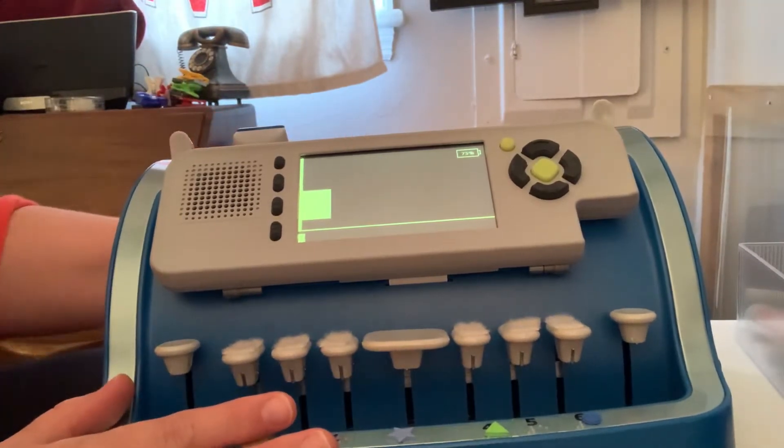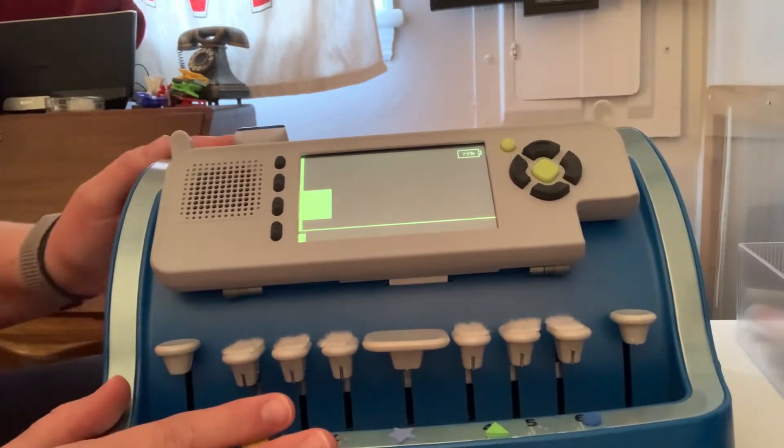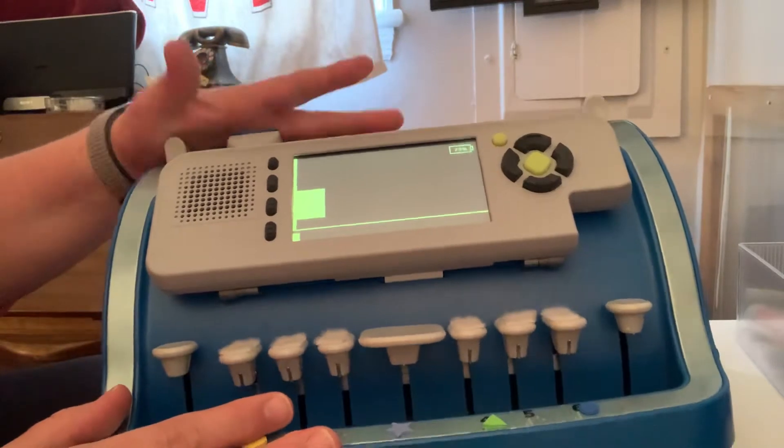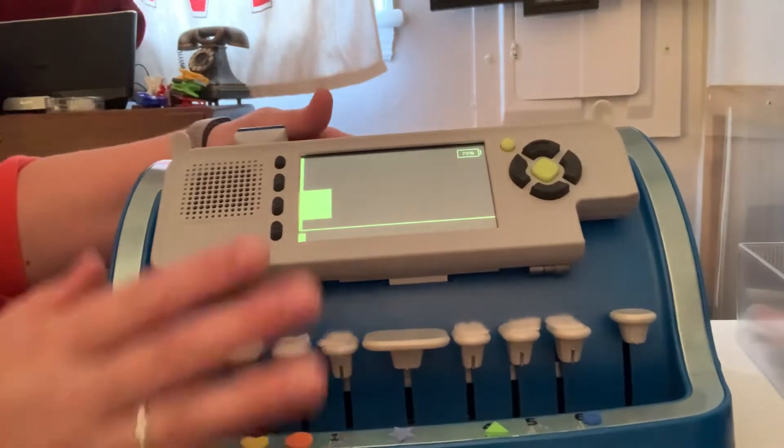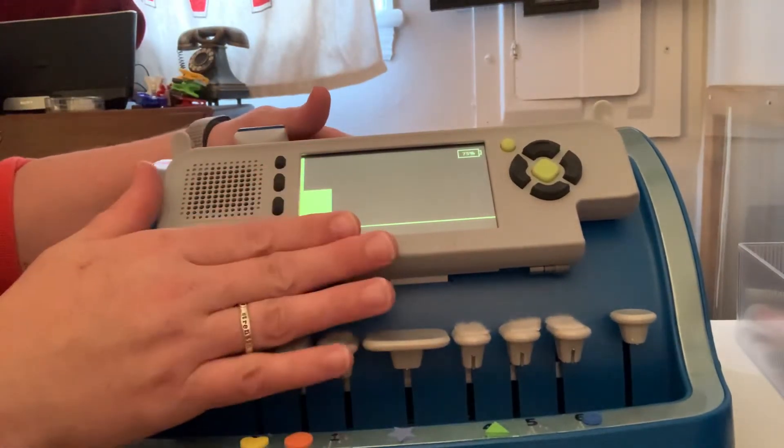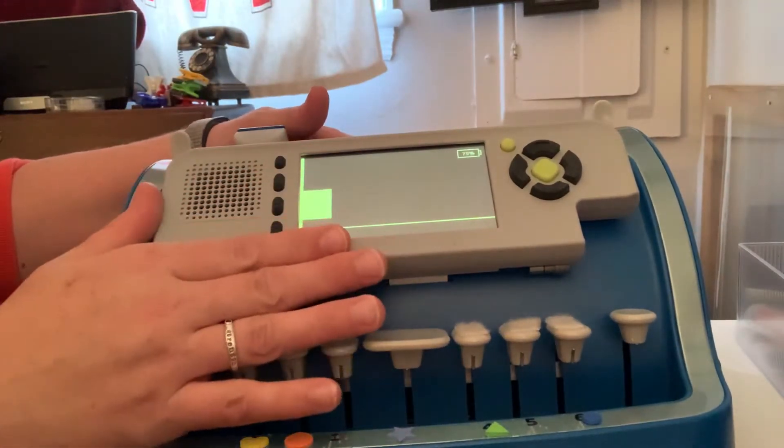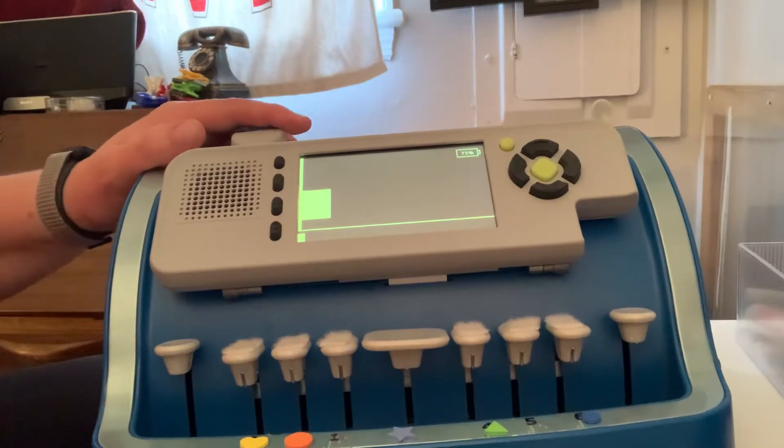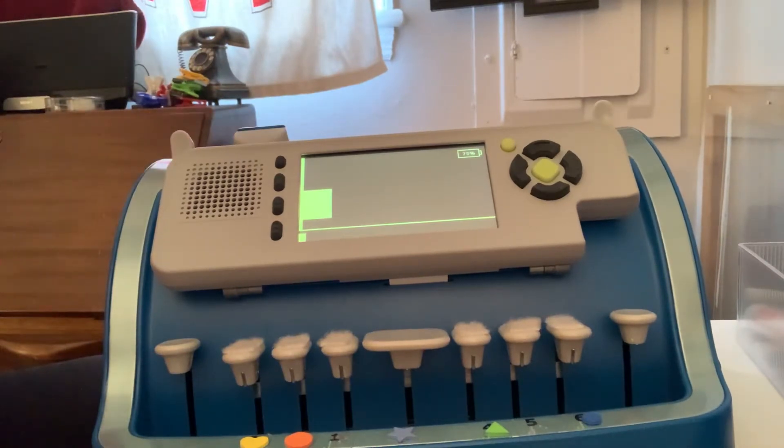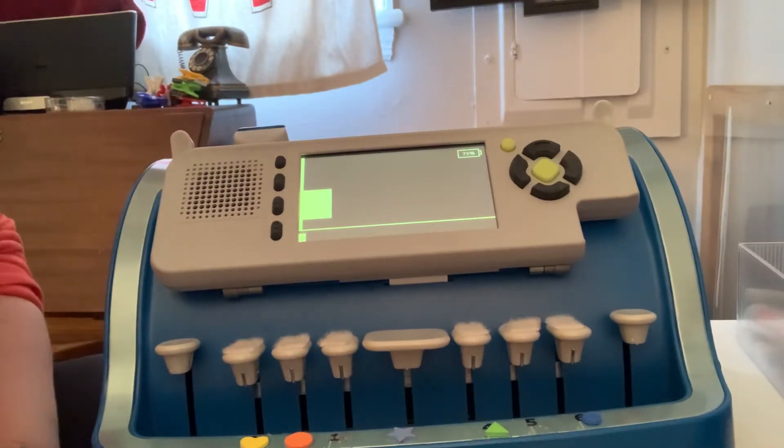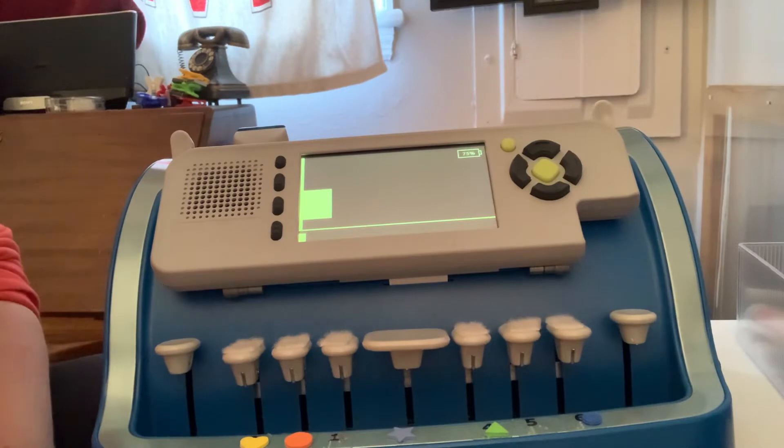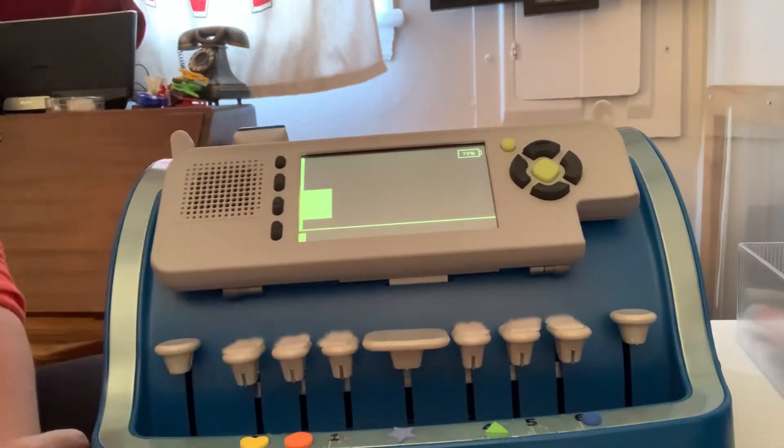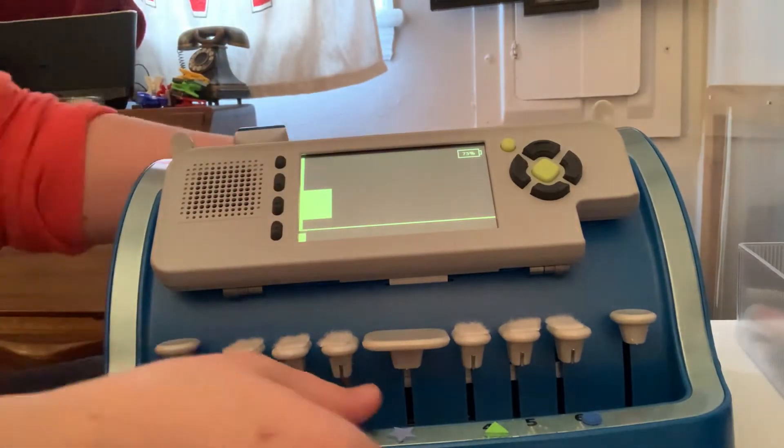It works without power and with power. I've got the power on right now, but you can use it without, which is what I prefer doing because I don't need the audio feedback. I can see what I'm brailling. So yeah, it works with or without.